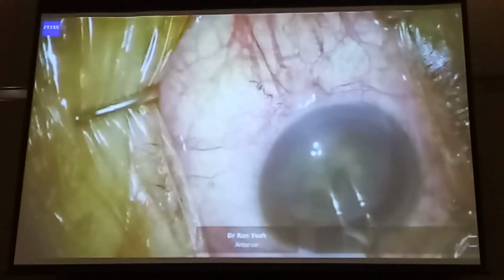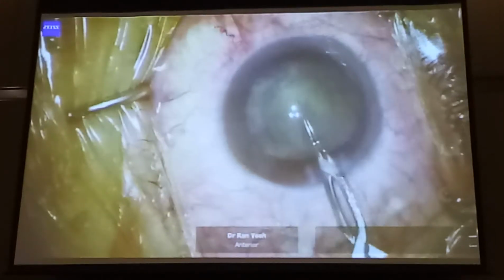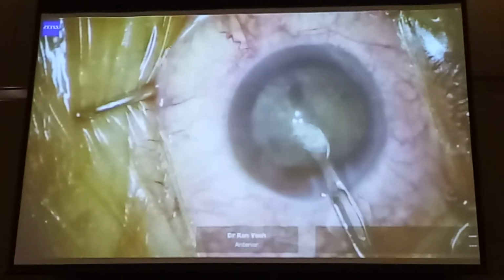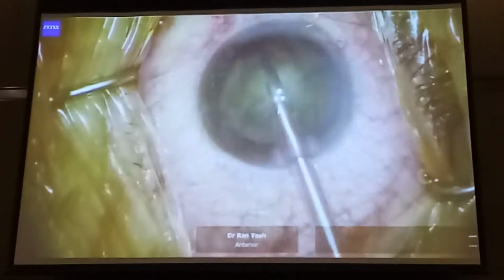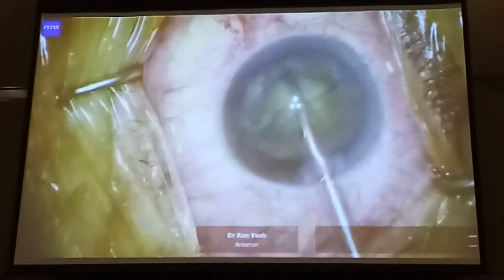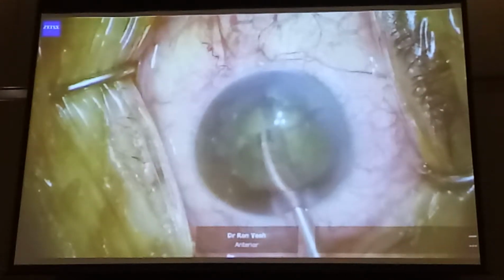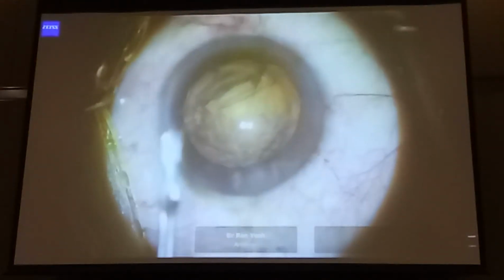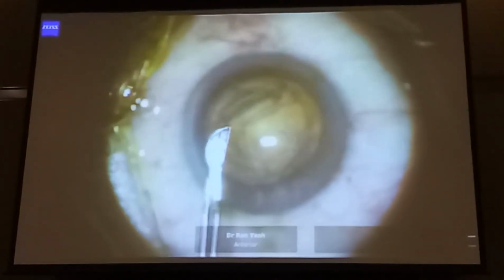So that was the first cut, here's the second, and here's the third, and you can crack it into 4 very, very easily. And I would say today about probably 80% of all my patients get a pre-chop like this up to 3+ nucleus, and it works really, really well. Here, let me show you the difference between the combo 2 and the combo 4 pre-chopper.